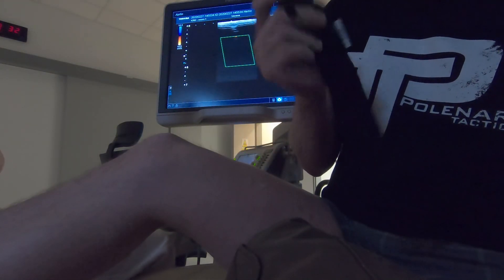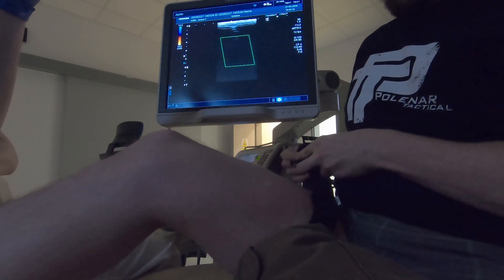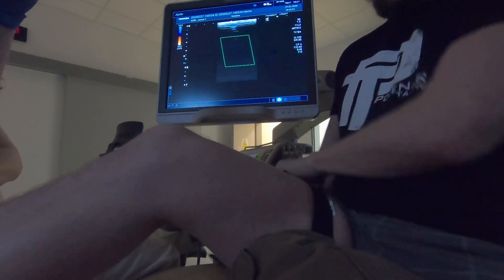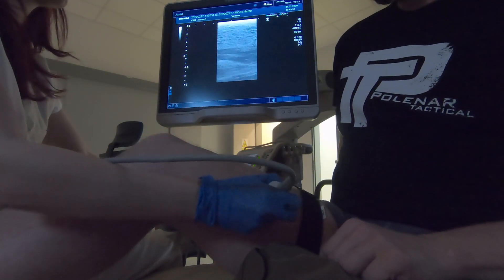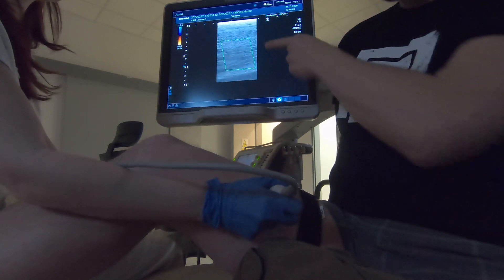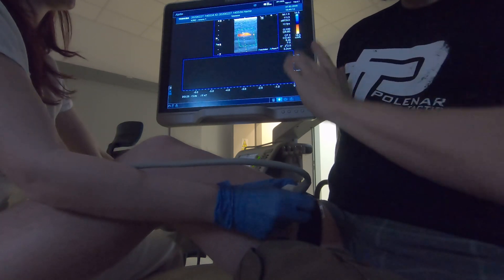Now it's time to try the brand new tourniquet on my leg. What you see is my femoral artery with positive blood flow. If you see the red color, that means there is blood.